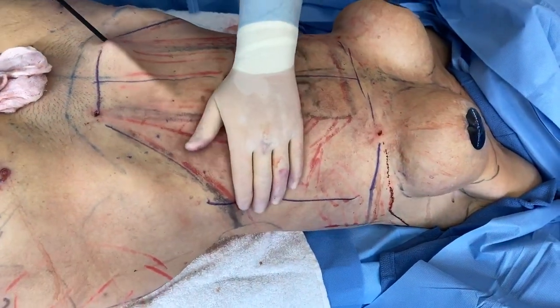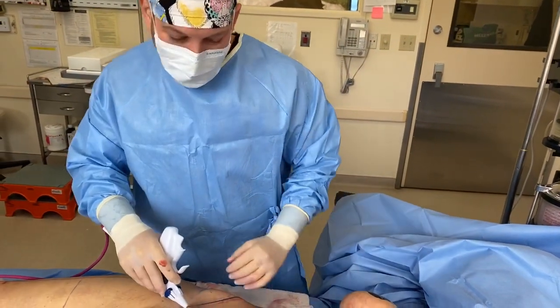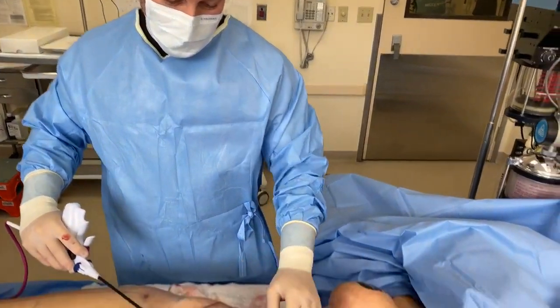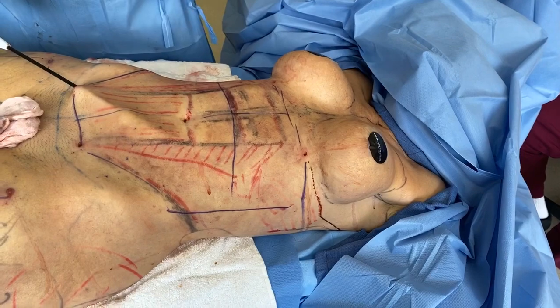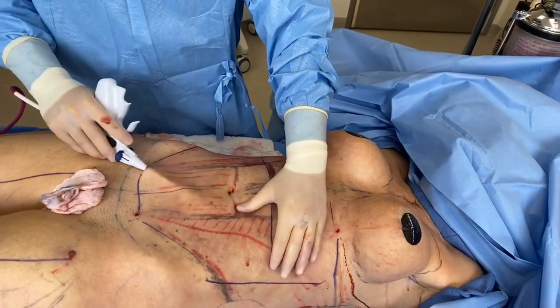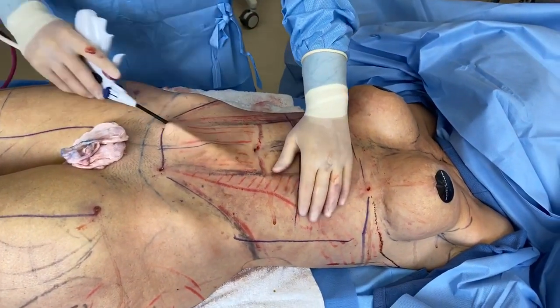If you're not using the internal heating, I find the results not as good. The gold standard now for all contouring and tightening procedures — not fat reduction, but tightening and athletic contouring — is Renuvion plus liposuction plus internal heating. In this case she has a lot of looseness in the skin.